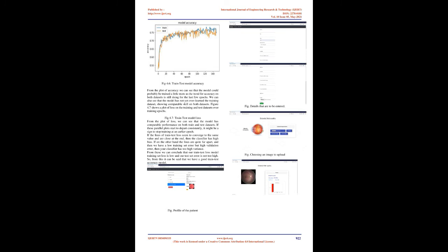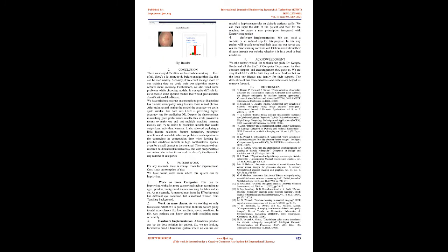From these we can conclude that our train test loss model training set loss is low and our test set error is not too high. So, from this it can be said that we have a good train test accuracy model. Fig. Results. 7. Conclusion. There are many difficulties we faced while working.